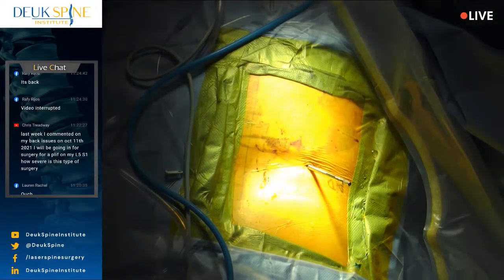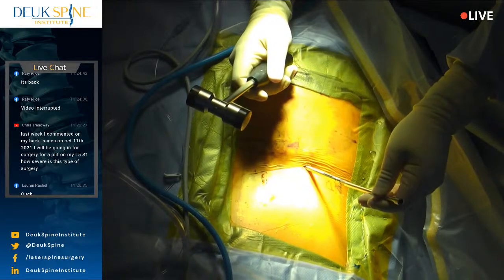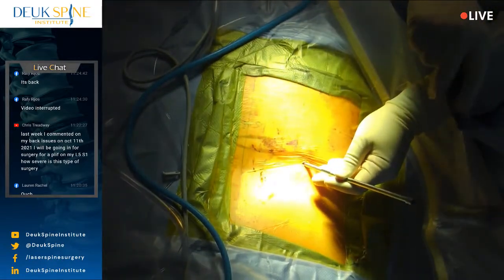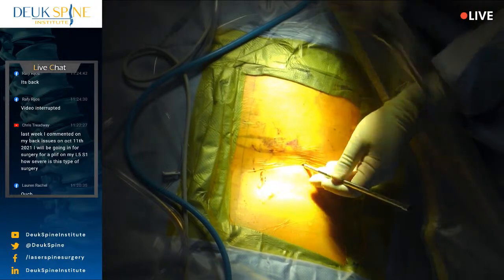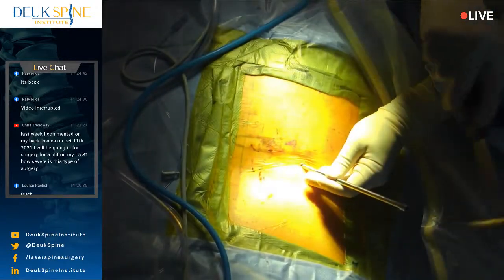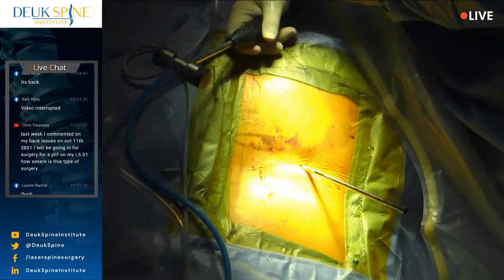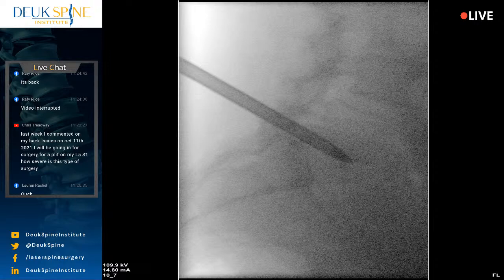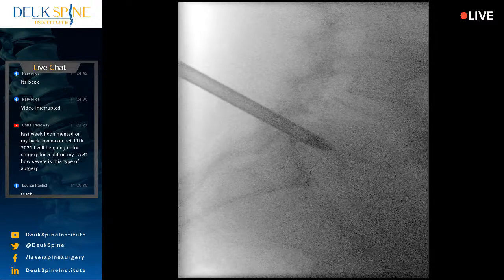They're pretty strong, but we had the last lumbar laser we did on a Canadian patient. He actually was so powerful with his muscles, he crushed 2 of my tubes, right? Two of them. I mean, yeah, that was incredible. But he had really collapsed discs, which this patient doesn't have, by the way. And he had just really big paraspinous muscles.